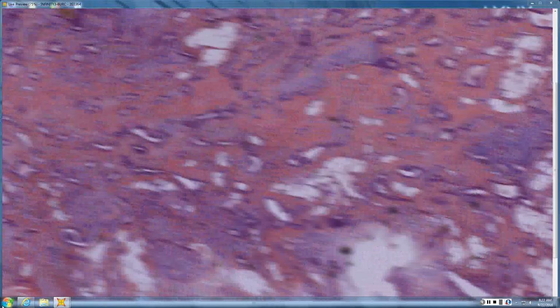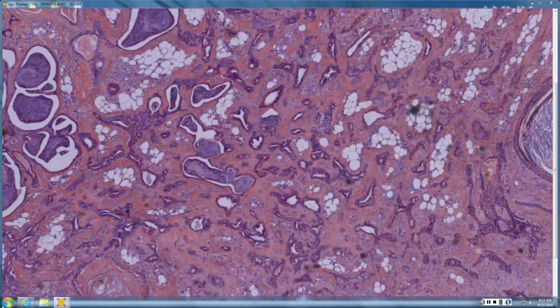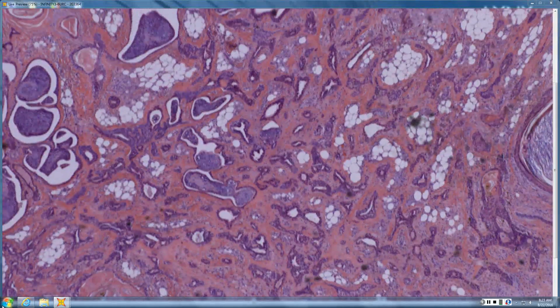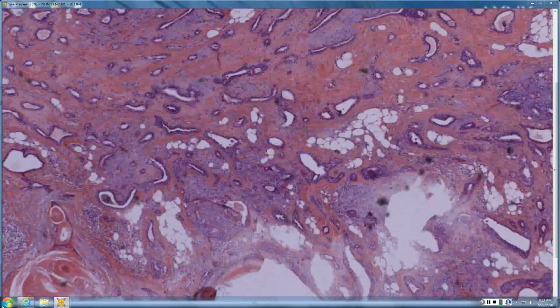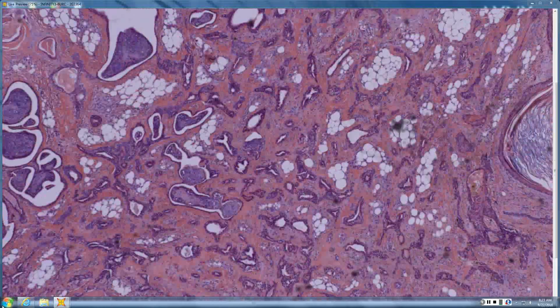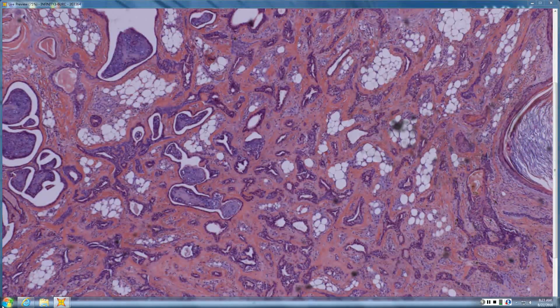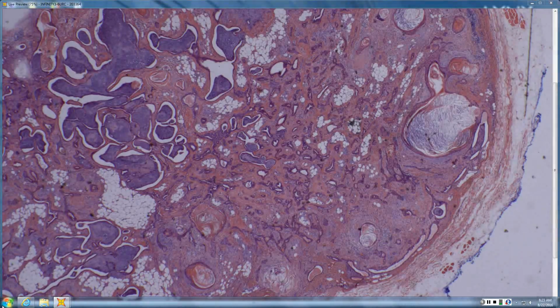Okay, so this I've got really pretty large nodule with pink stroma with these blue chondroidy islands in it. Yes, you have blue chondroidy islands, and you have a branching and alveolar anastomosing pattern of ducts. So it's a branching alveolar mixed tumor. Yeah, and the stromal element, some of it's chondroid, some of it's fatty. So another mixed tumor. Mixed tumors have endless variety, and it's a common tumor, so for path boards, I'm sure they would probably test very well because endless variety of a common tumor, they don't all look just like the picture in the book. So you actually have to know what you're doing to work your way through them.